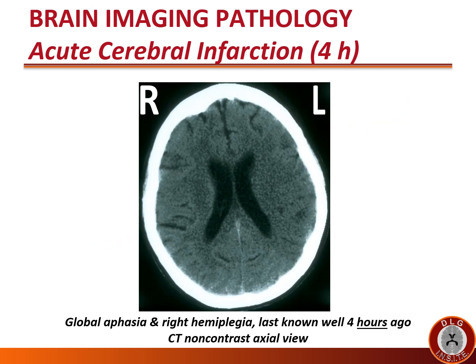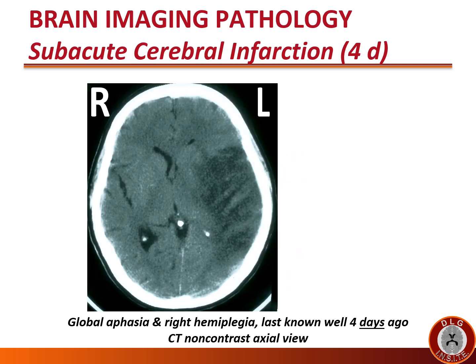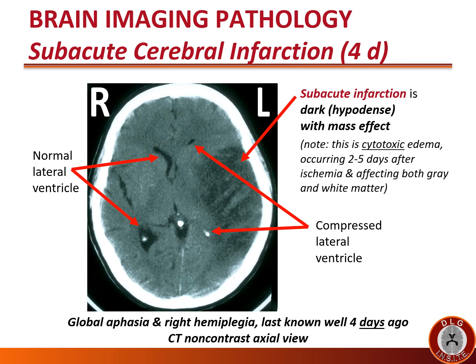Four days after last known well in the same patient, the subacute infarction is more easily detected on CT. The subacute infarction is dark or hypodense with mass effect. Note the compressed lateral ventricle on the left. This darkness and mass effect is due to cytotoxic edema — the cells die and rupture in the infarction — occurring days two to five after ischemia and affecting both gray matter and white matter. The unaffected right side still has normal lateral ventricles.